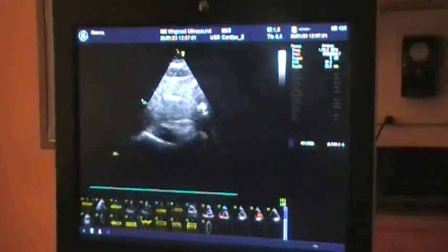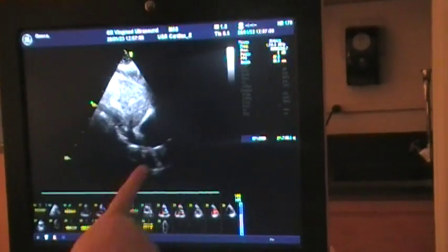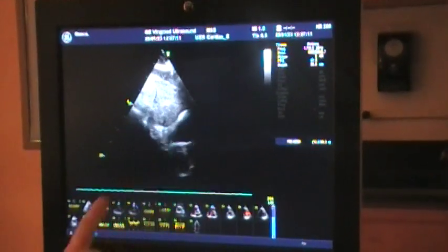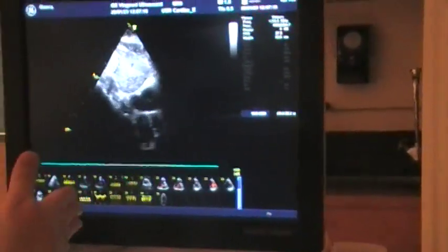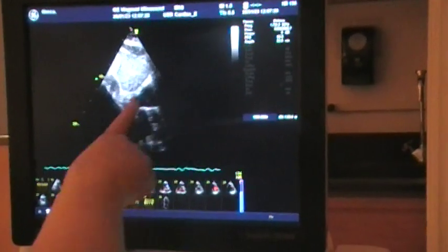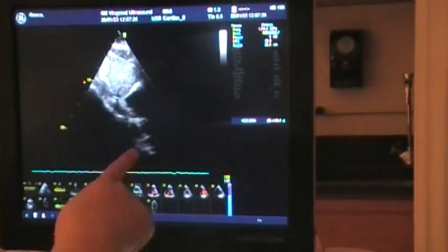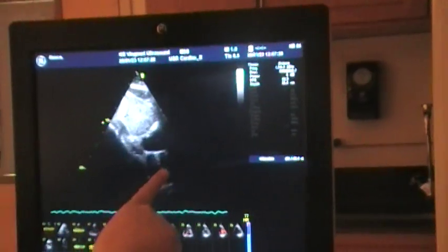All I'm going to do is turn my reference point from 3 o'clock to 12 o'clock, so up towards your patient's head. And that's your notch, right? Yes. Yeah. So I've got a short axis view now of the heart. And depending on where I'm pointing, if I'm pointing straight ahead, I should have their aorta right there in the middle. So this is your short axis aortic valve level that we saw in peristernal. It's the exact same anatomy. So this is tricuspid and pulmonic, aorta in the middle.